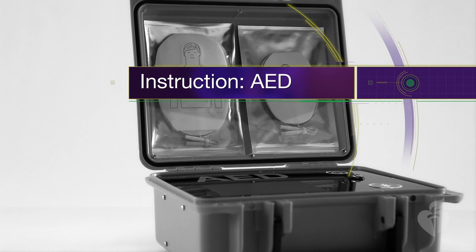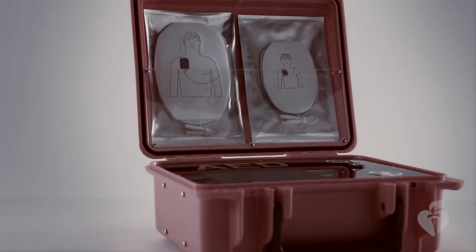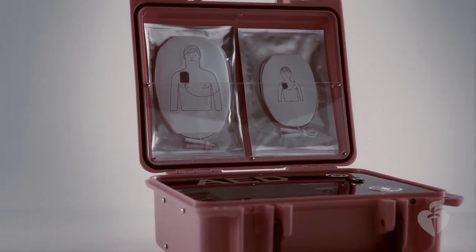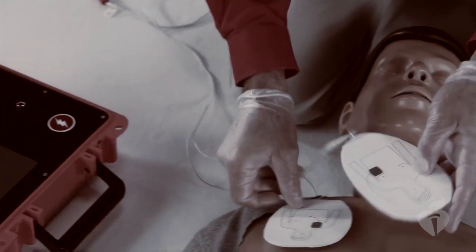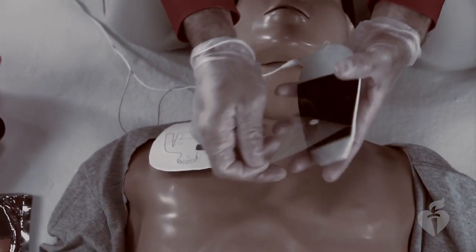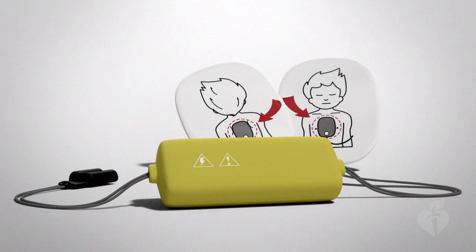Now, let's focus on the use of an AED. You'll need to familiarize yourself with the AED device that you'll be using today for your training class. There are some differences for the use of an AED for infants and children under 8 years of age. Some AEDs can deliver either an adult or child shock dose. The child dose is used for children under 8. If you are using a pediatric-capable AED, it will have features allowing a child-appropriate shock.